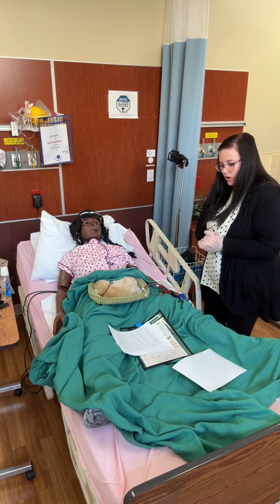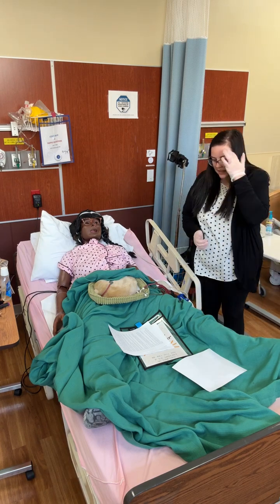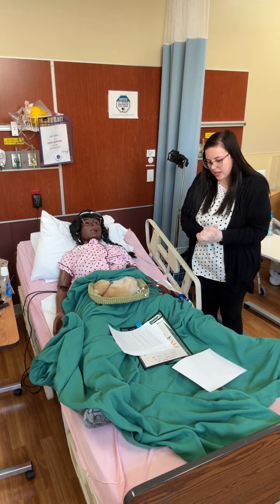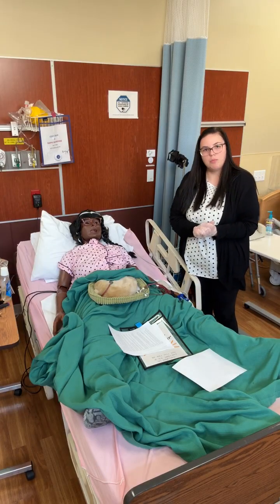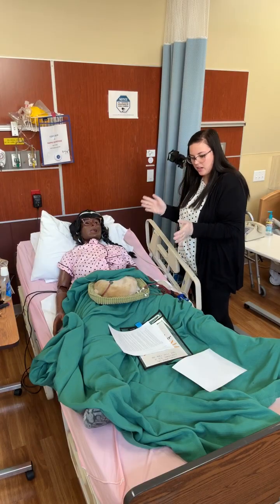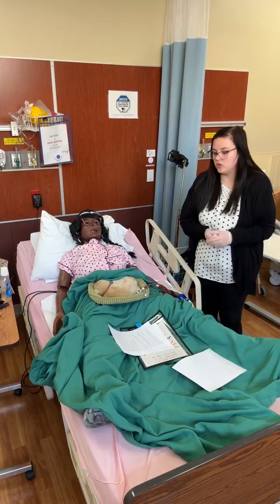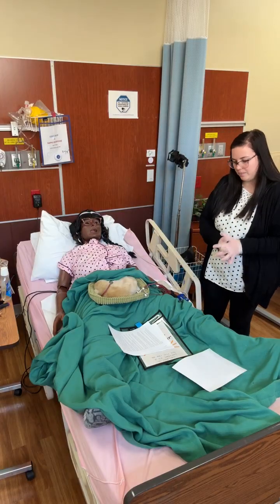When you are doing a head-to-toe assessment, it is important to ask the sim staff for specifics. So, for example, if you want to know if the patient has palpable pulses, this simulator has radial, brachial, femoral, and pedal pulses that you can palpate. So you can go through all those motions and feel them.